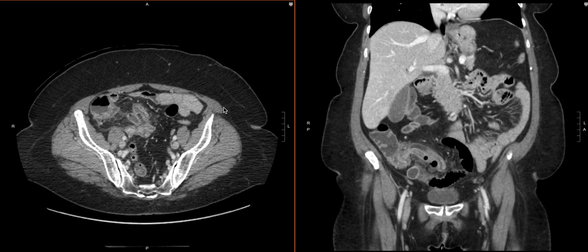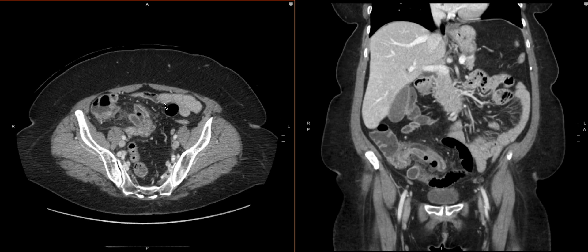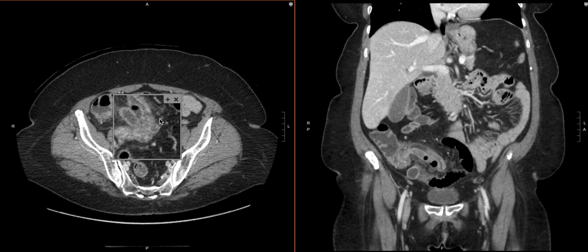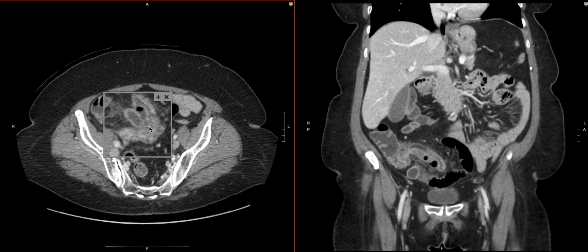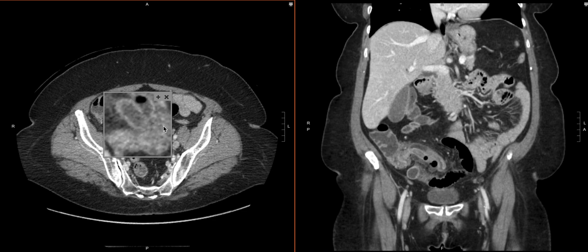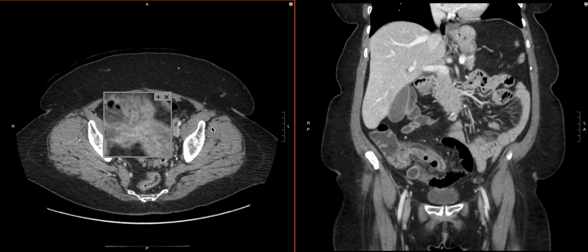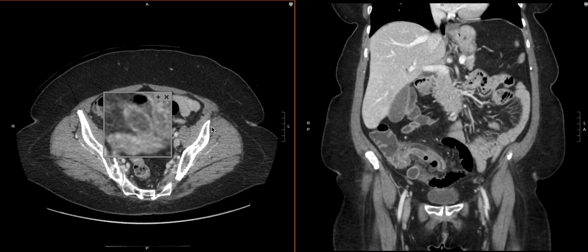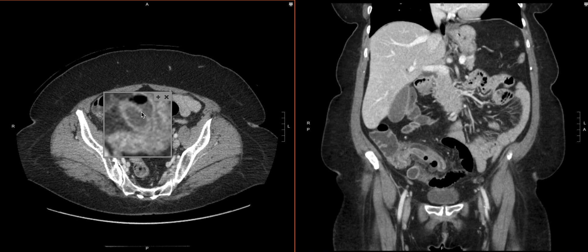If we look really, really closely on this slice right here — I'm going to zoom up — we can actually see that the wall here gets a little indistinct. Scrolling right there, there is what looks like a defect in the appendix wall leading into this little bit of free fluid and little bit of free air. And that is a really good look for perforation.